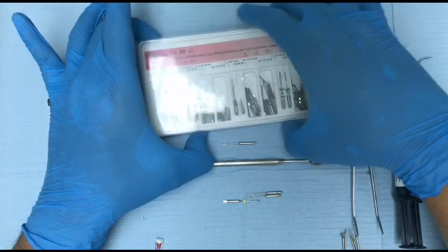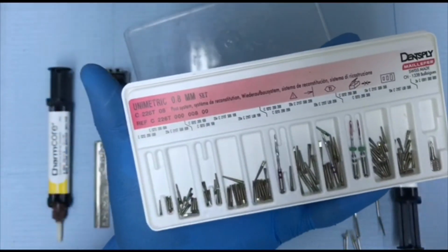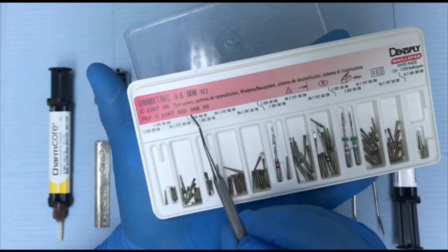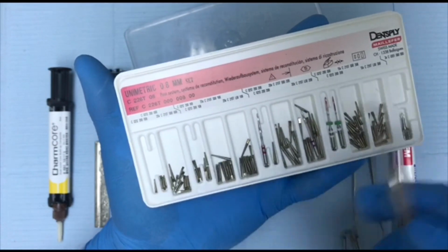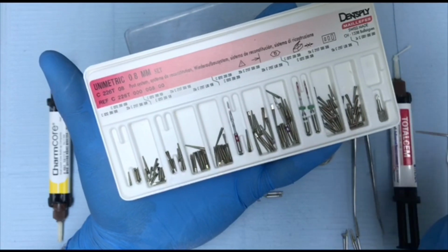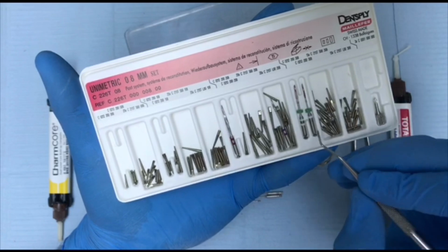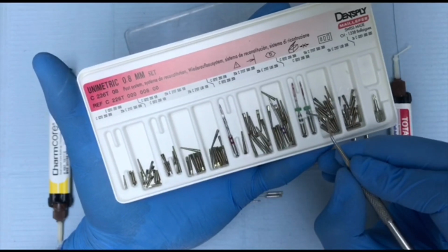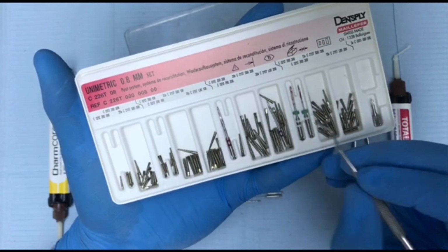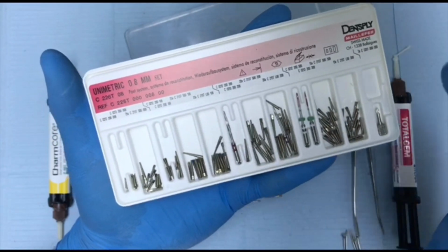This kit is for the metal posts. It's from Dentsply. And as you can see here, all of these posts have the same diameter, which is 0.8 mm, and the kit consists of different lengths, and you have to choose the length that's suitable for each case. And each length has 2 drills: the pilot drill that is responsible for removal of the gutta percha from the root canal system, and the actual working drill.